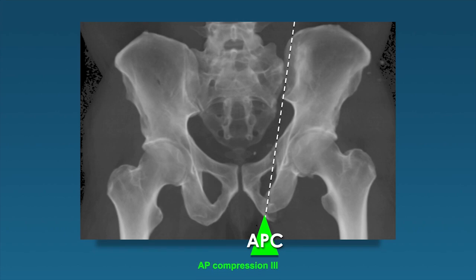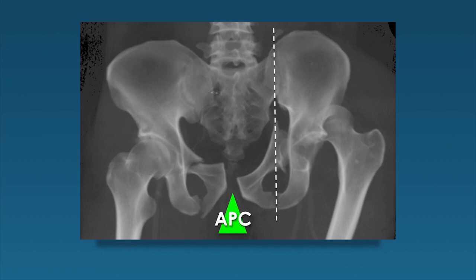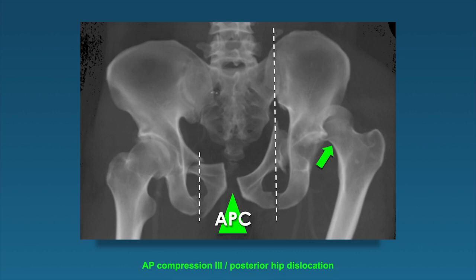Another APC type 3 example with a slightly off-midline force disrupts both the symphysis and the obturator rings bilaterally. We see the force going all the way through the SI joints and tearing off the transverse process of L5. We have posterior injuries involved with that broader anterior force and obturator ring injuries on the patient's right side. Note the hip on the left side—posterior dislocation—which goes along perfectly with this scenario: APC type 3 with posterior hip dislocation.